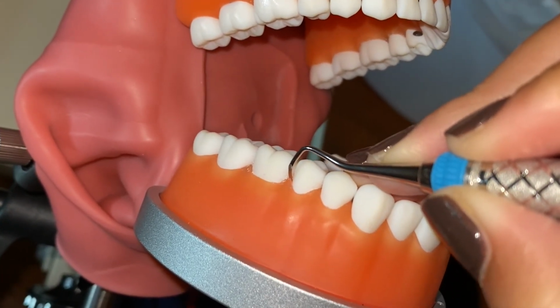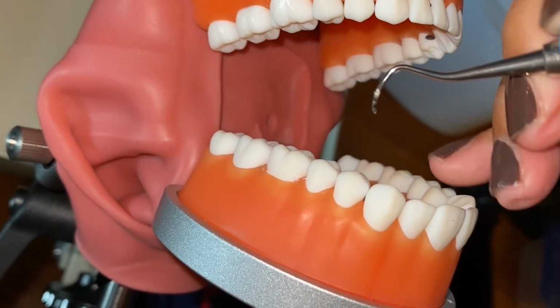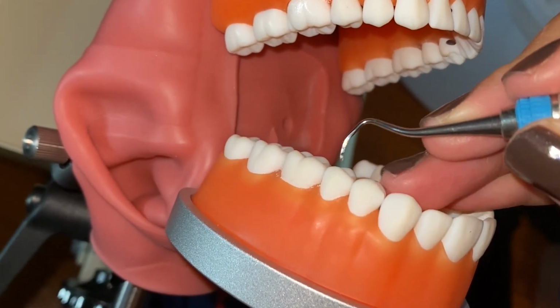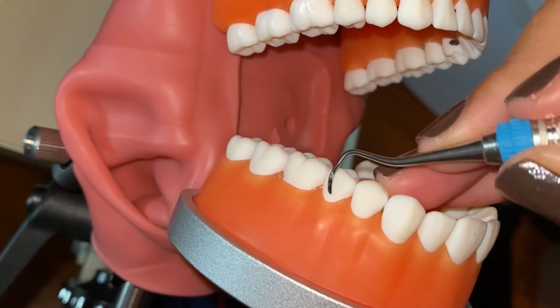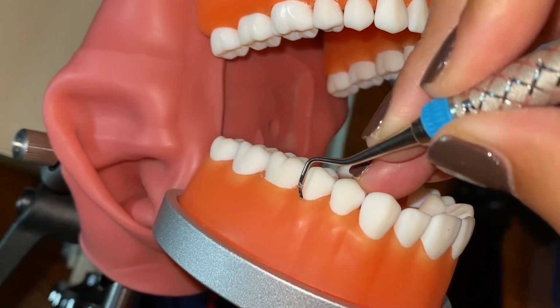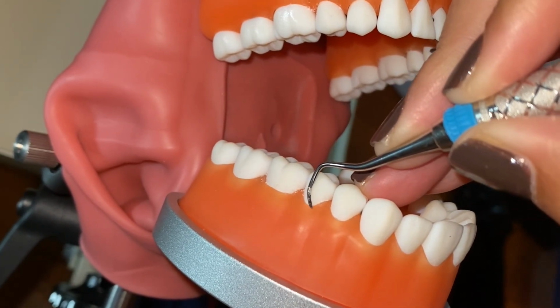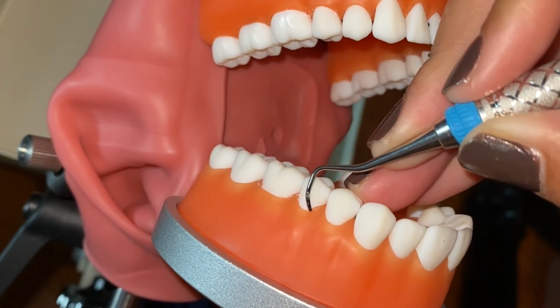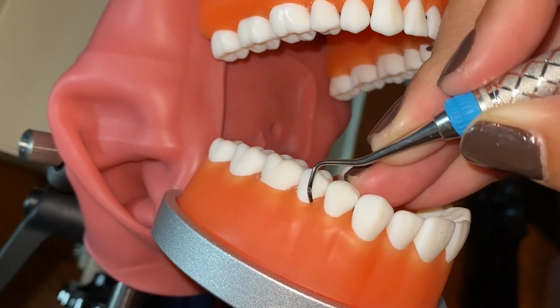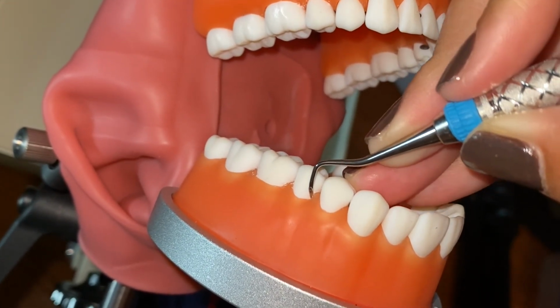And inserting again at that distal line angle, opening up the blade, up, down, pivot, roll, up, down, pivot, roll, up, down.